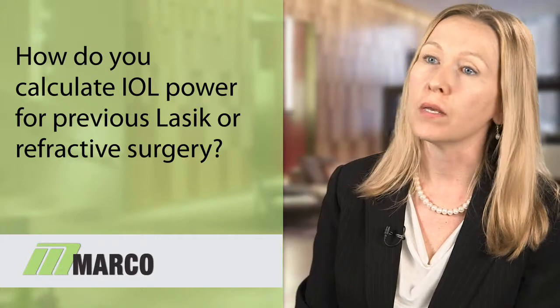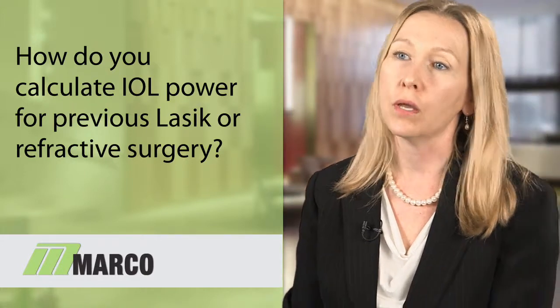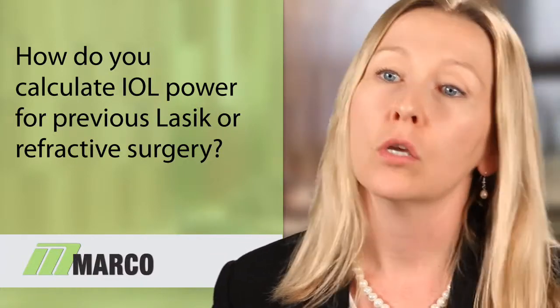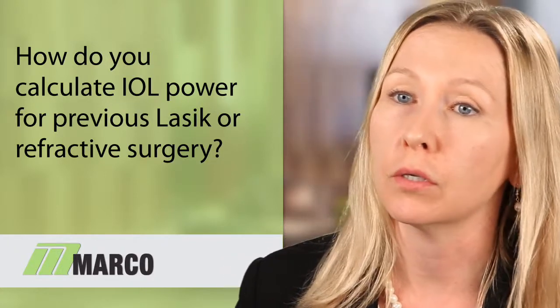In my experience, what I have found is that the ECCP, the estimated central corneal power, the number that we derive from the OPD, is a very, very useful number to use for patients in post-refractive cases. And many times, if I have no other information, no historical data, I use that number frequently to plug into the formulas and to derive the IOL calculation. I have found that to be a very accurate way of determining the central corneal power in post-refractive patients.